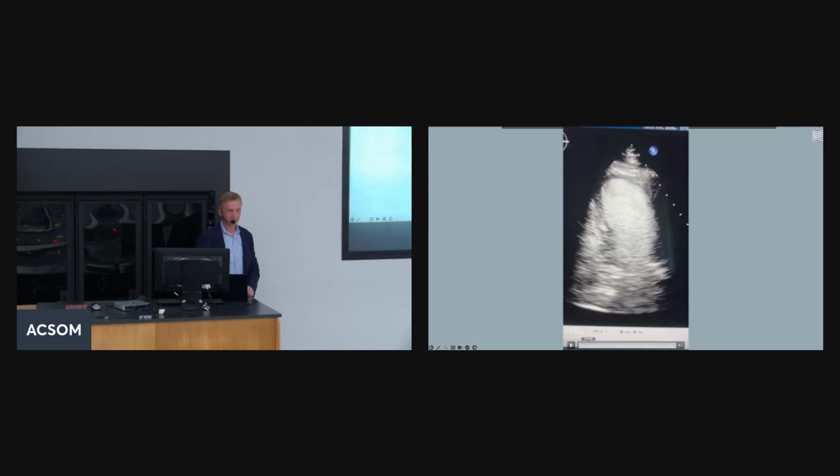So let's go to the electrical. What do you think you find on the electrocardiogram when you see this ultrasound image, in patients who had a large apical or anteroapical infarct involving the anterior wall? You may see lower magnitude, yes. Do you see anything else?